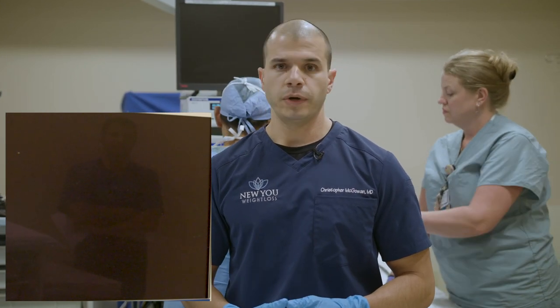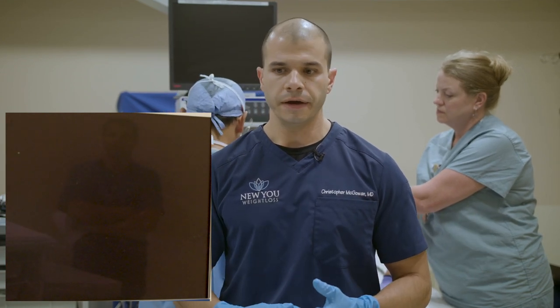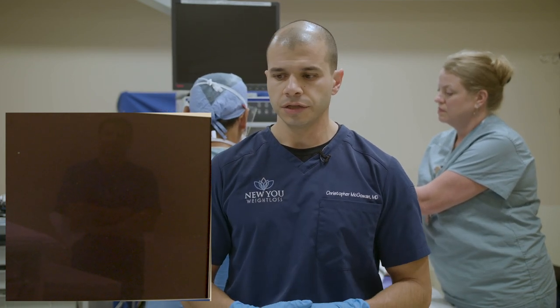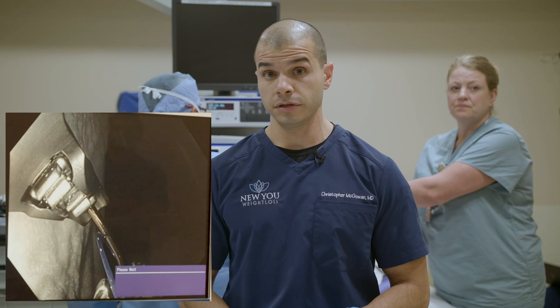Our patient today is a great example of a good candidate. She gained weight after she retired several years ago, became less active, and started gaining weight. She also quit smoking a couple of years ago and gained weight after that. She started developing joint pain and is really trying to lose weight to get her joints back in health, get active, and get healthy overall.